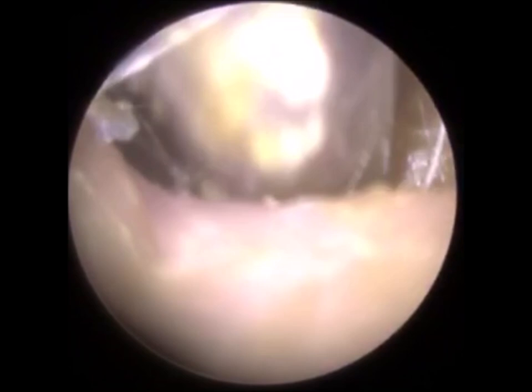Sorry, I've not edited this part. It's just probably missed it. So I was just going in with the ear hook there, got a piece of keratin out. If this was a normal ear canal, we would have finished by now, because the amount of wax, or not wax, sorry, dead keratin I've removed so far is an incredible amount, and you'll see that at the end of the procedure. I've got all the still images. So it's almost like I'm doing four ears in one go. This is a piece of this hard keratin that's been in there for a while, it's oxidized, and it looks like wax, but it's not. I managed to remove some of that by using an ear hook. And again, apologies, I didn't edit this. I must have just missed this bit out.